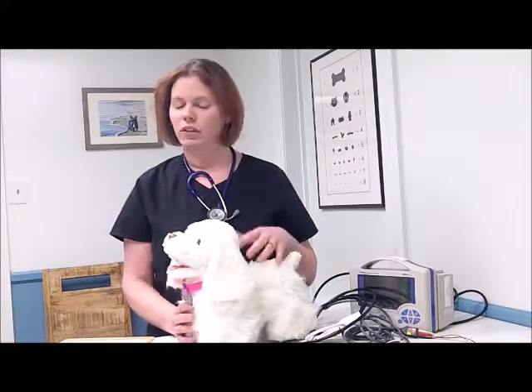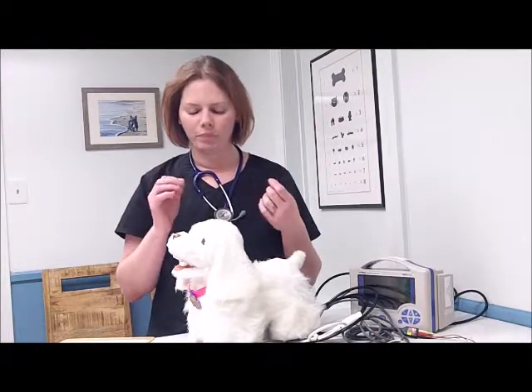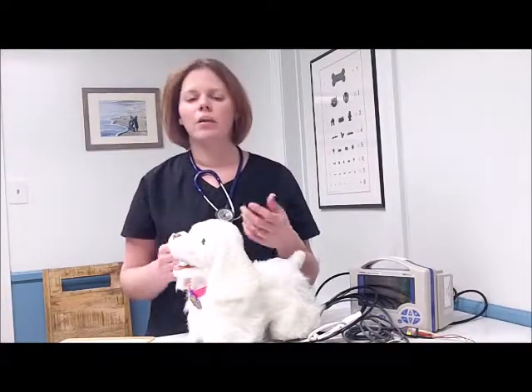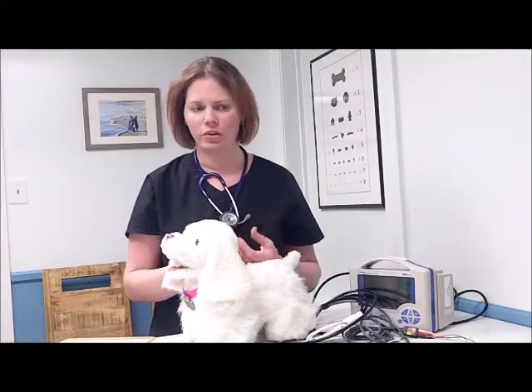It is definitely present in an awake animal. It's that reflex of when something touches the pharynx, the epiglottis automatically closes and they want to swallow. This is very common in cats, even after induction. They have very sensitive larynxes, and so as you go to intubate, intubation can be difficult because as soon as they feel that touch of the tube, the ET tube, or the stylet, whichever you're using, that epiglottis tends to close and those vocal folds close, making intubation difficult. Hence the reason lidocaine can sometimes be dripped back there to aid in your intubation process.